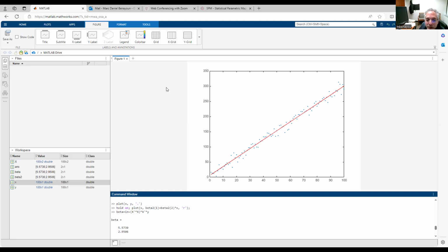But in the research environment, I think false discovery rates are one of the better compromises. Bonferroni, just so you know, just tends to throw out too much real data. It just throws out so many voxels that are actually responsible for the task because it's such a stringent thing to take 0.05 and divide it by 100,000 t-tests and then set that as your new cutoff. It's just so low that you lose voxels that are responsible.